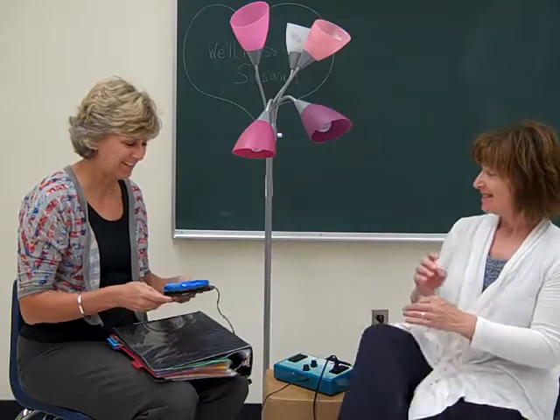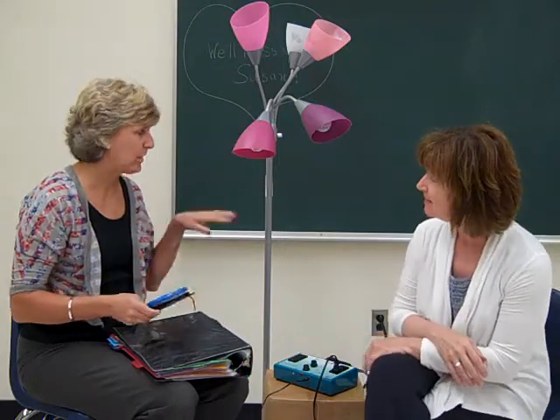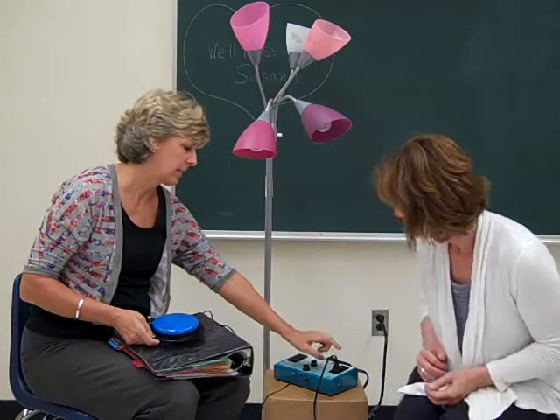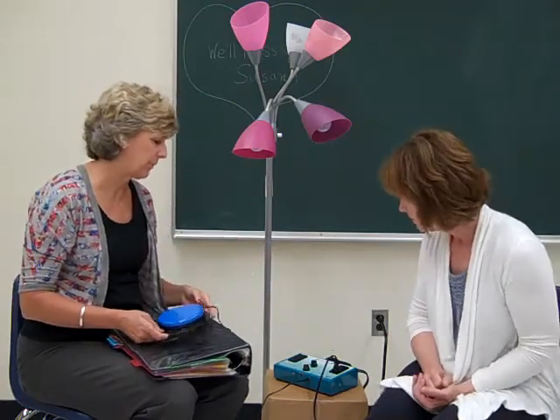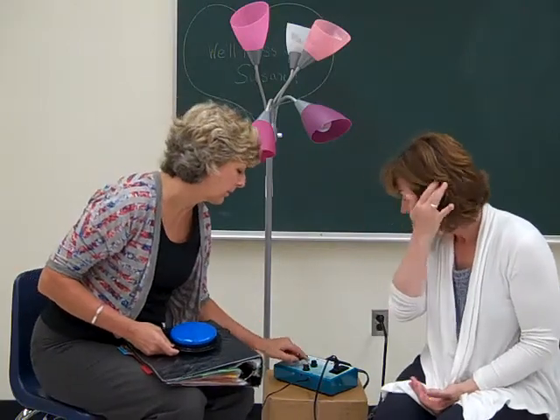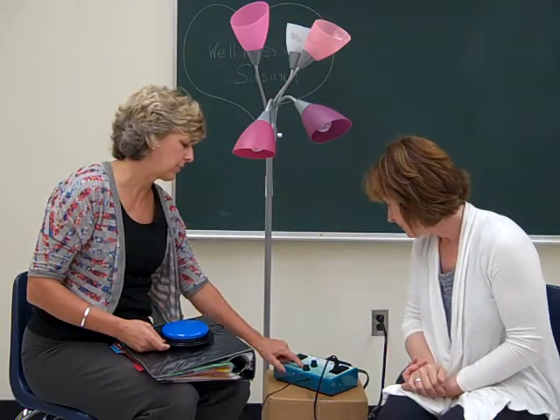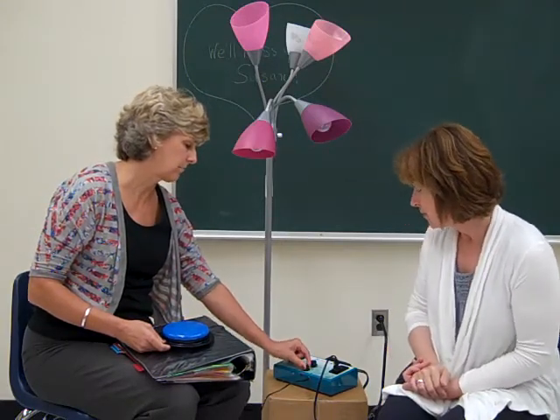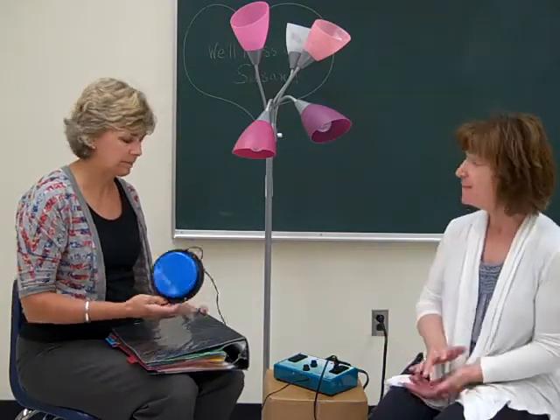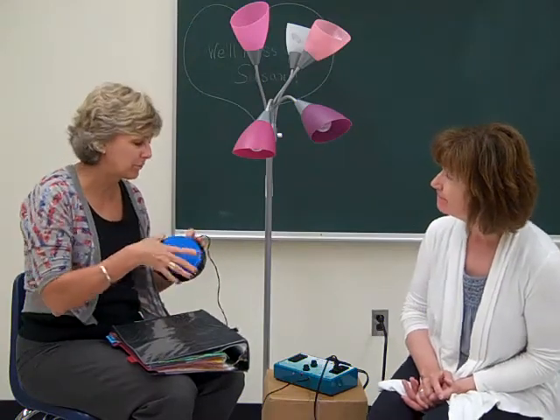I'm going to do switch work with Jane, and we also have a radio that's plugged into the same side as the light. Get that from the library — just sign it up for the year and you're good to go. I put it on timed, and I usually run it around 30 to 45 seconds. That's the duration until the power comes off. And then there's the big blue switch, which is also the big red switch because we can take off the different covers.